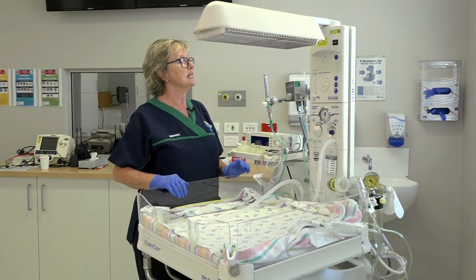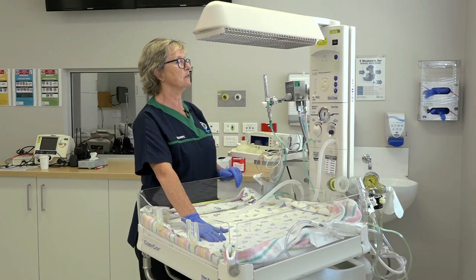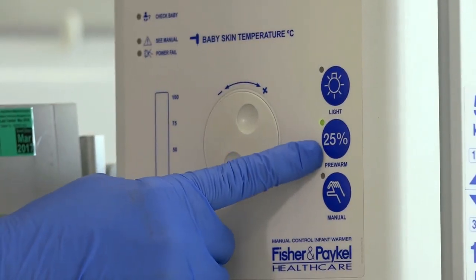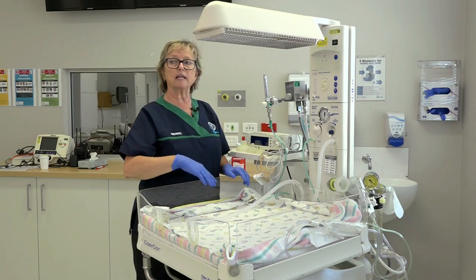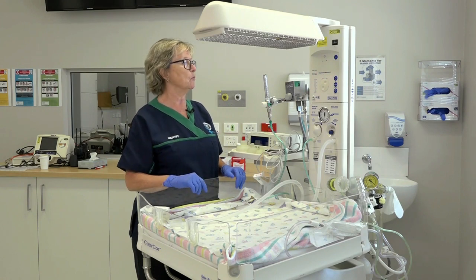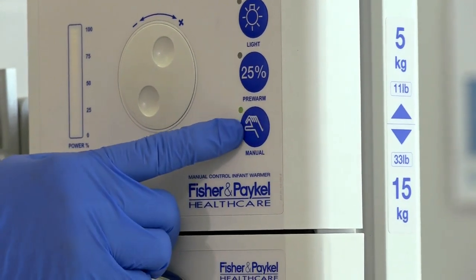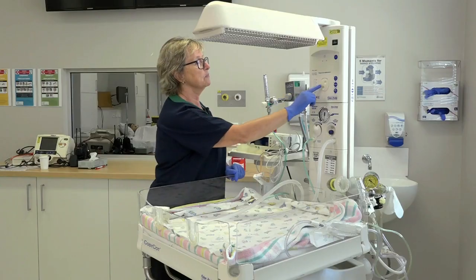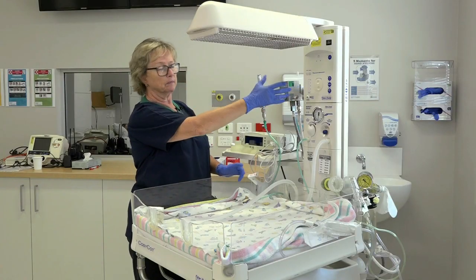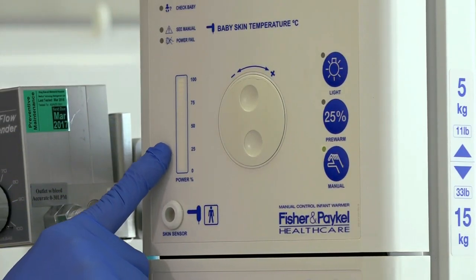The next thing we look at is the temperature, because we want to have a nice warm surface onto which to receive the baby. When the cot is not in use, it's going to be on 25% heater output or in a pre-warm. As soon as we are anticipating a resuscitation from a birth or a baby on the ward, we're going to turn the temperature up using the manual button. If we need to increase the temperature, we'll use this adjustment dial, and you can see that the percentage output is indicated here.